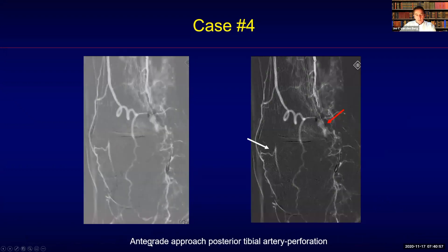I tried to recanalize the posterior tibial artery first because of the presence of a relatively good posterior tibial artery and plantar circulation, but that was not possible — I perforated. However, on a more selective angiogram, you can see that there was still a target vessel here: the dorsalis pedis.